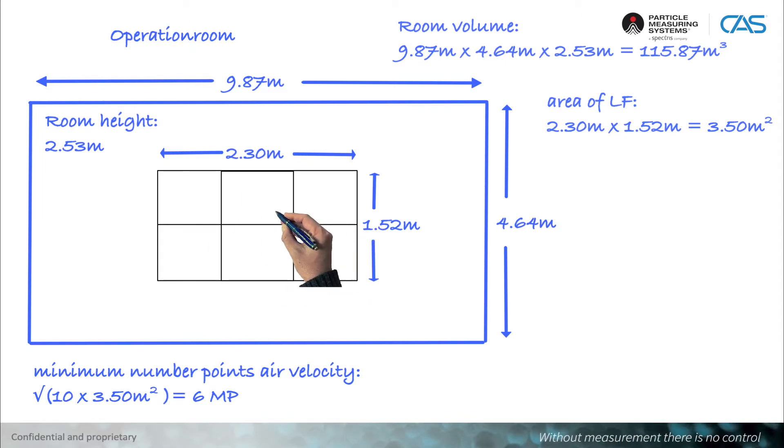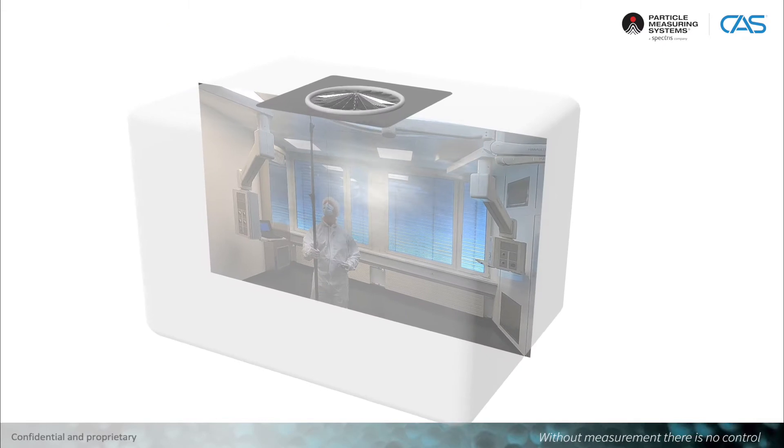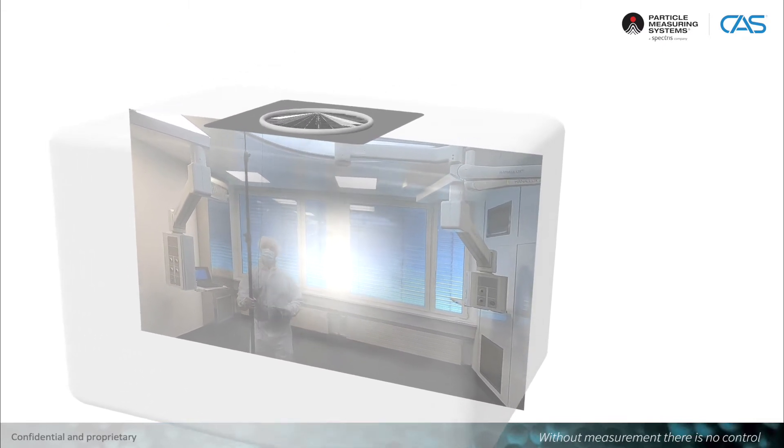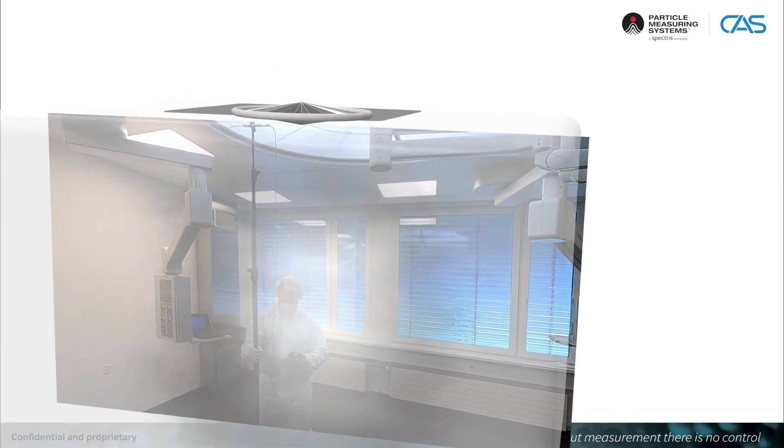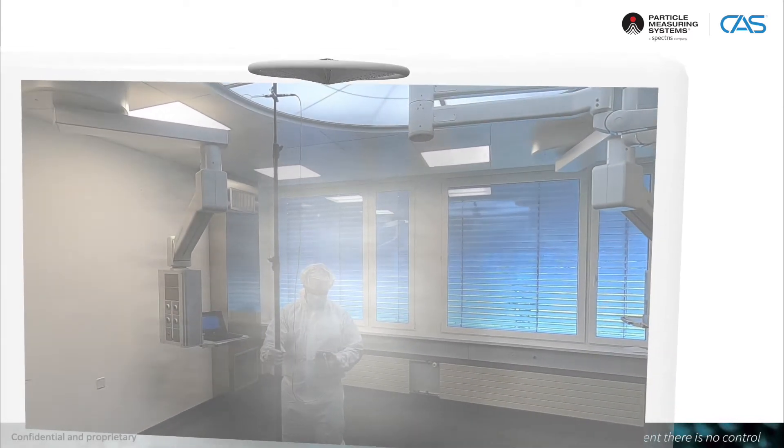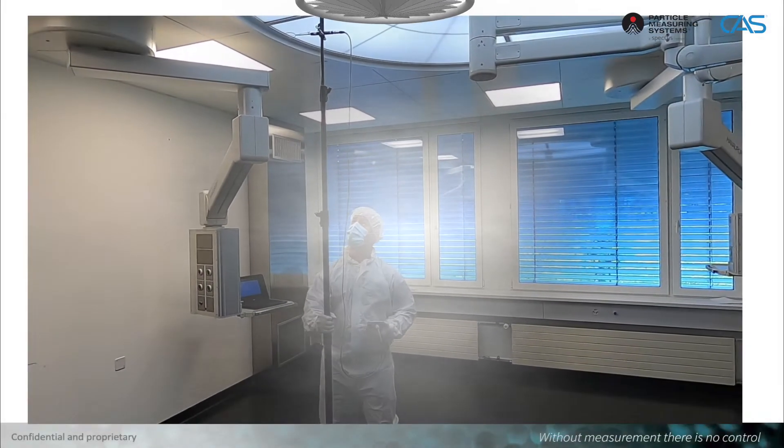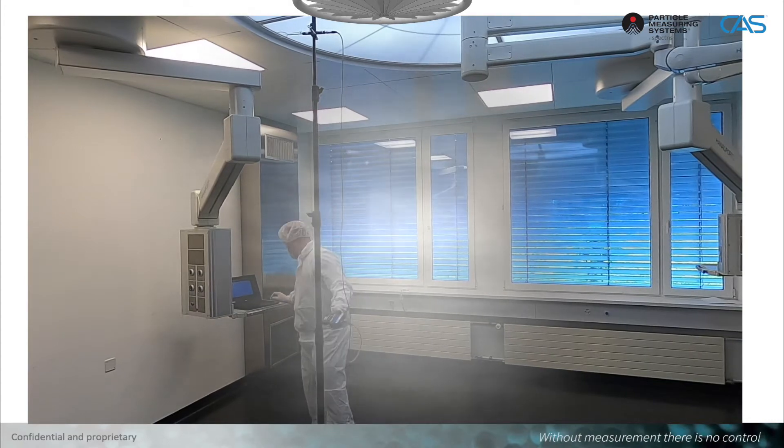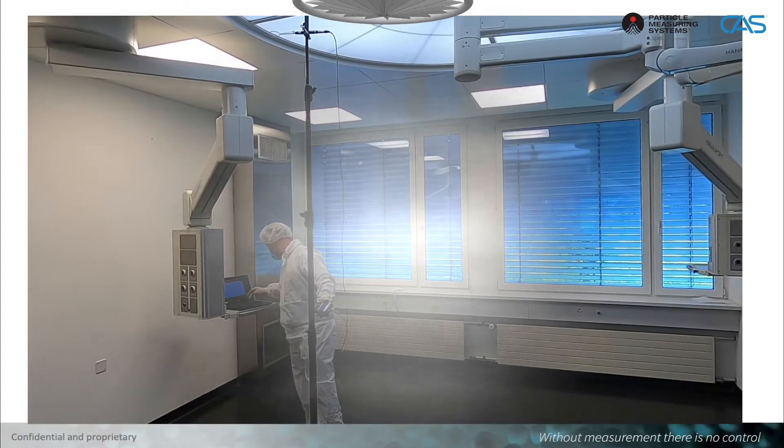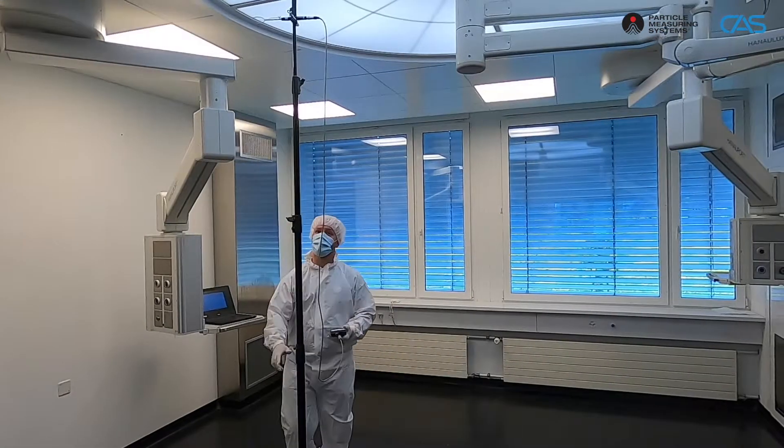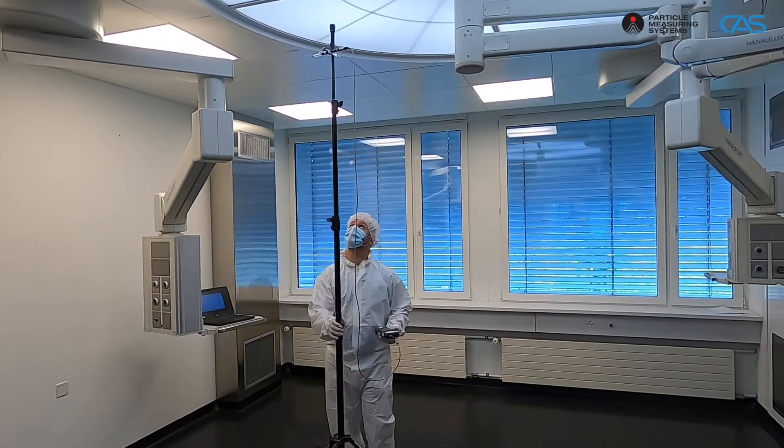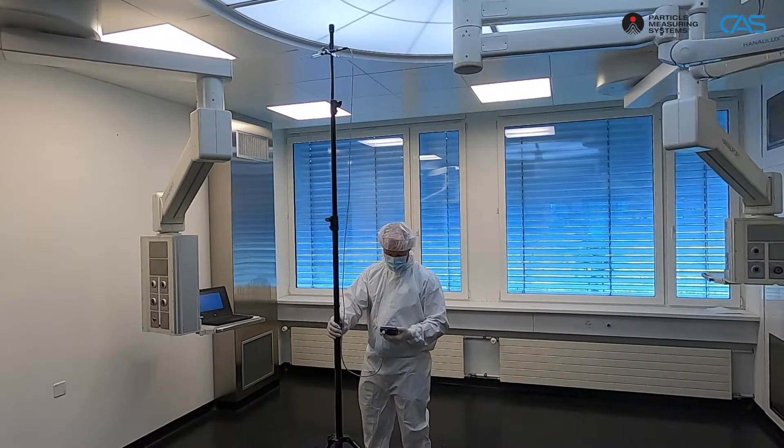The number of measuring points and their position must also be documented accordingly. Ideally, they should be evenly distributed over the air outlet element. As mentioned earlier, the air outlet element here is a laminar flow, or LF for short. This ensures that the air is guided downward evenly, i.e., laminarly.